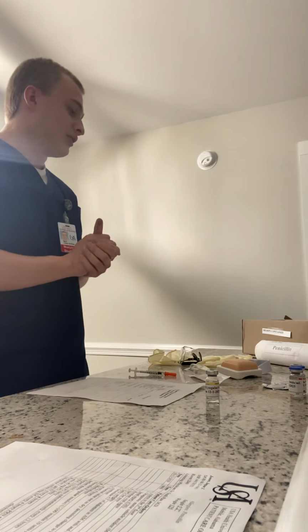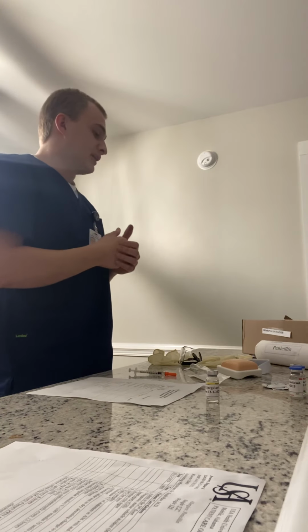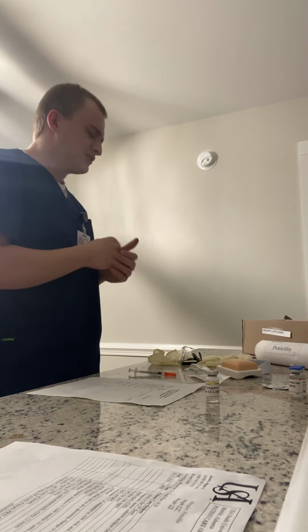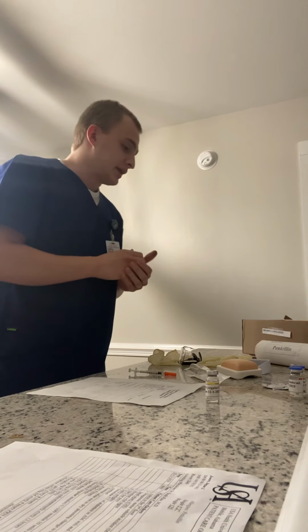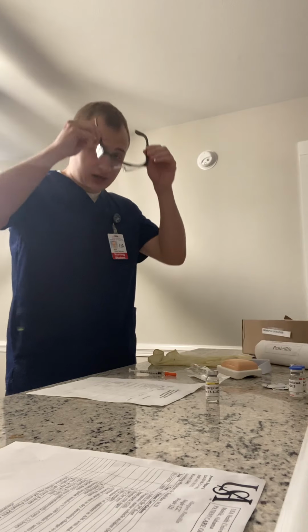So at this time, I would explain the procedure to the patient. So Mr. Jones, we will be performing a subcutaneous insulin injection today, and you should just feel a little pinch. And I would also raise the bed to a proper working height and lower the side rails. So at this time, I'm going to put on my goggles and my gloves.